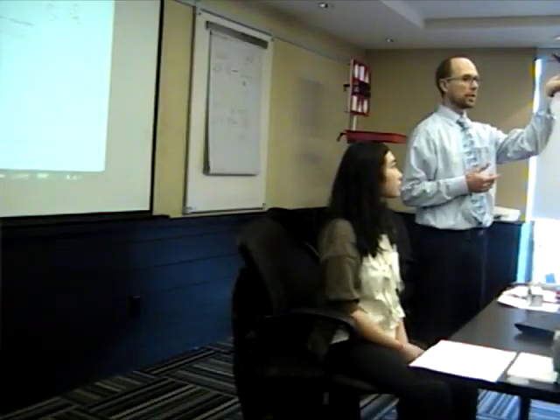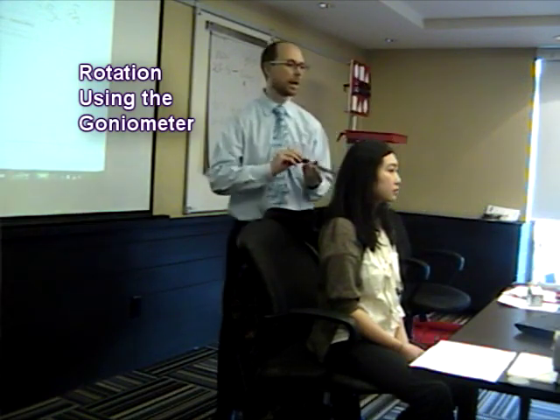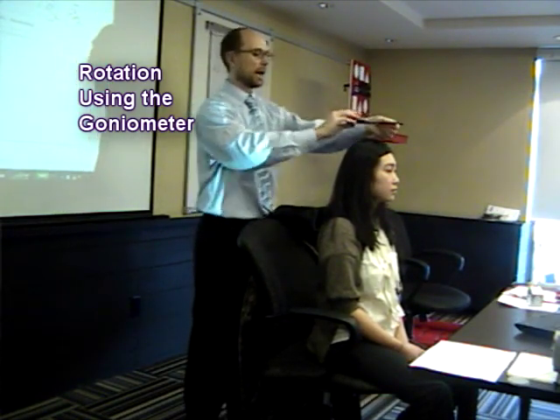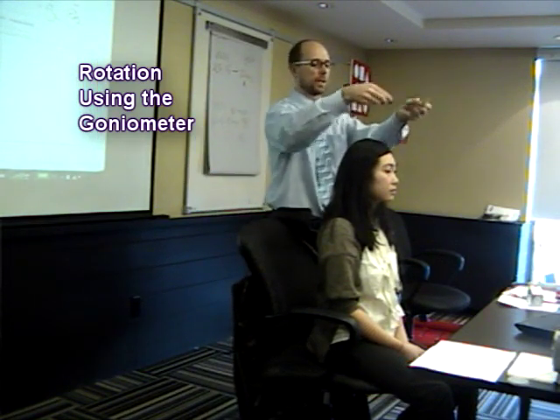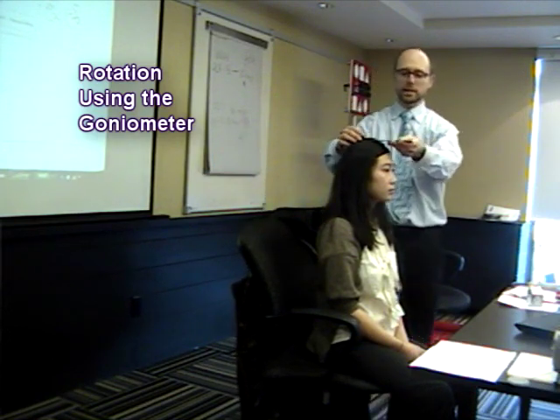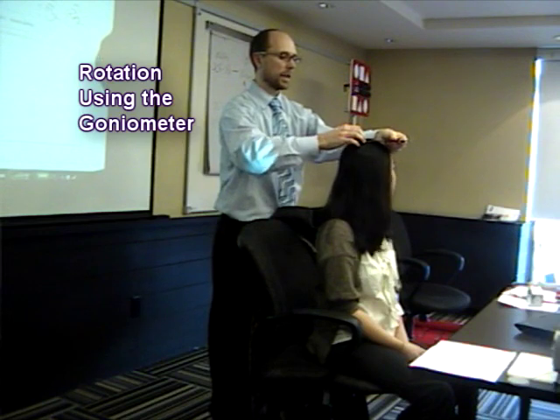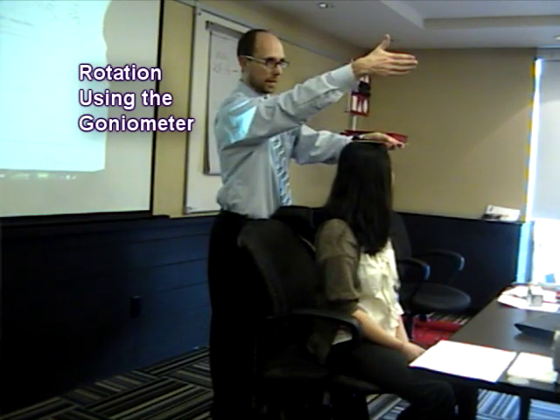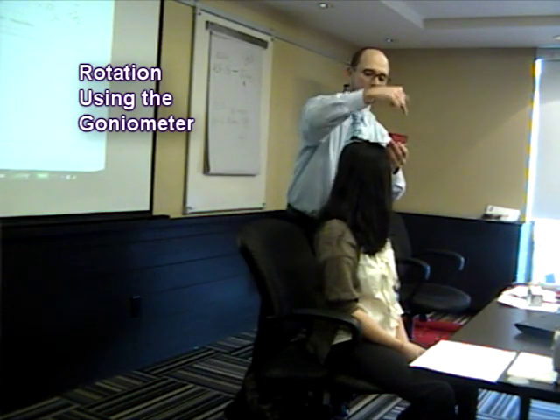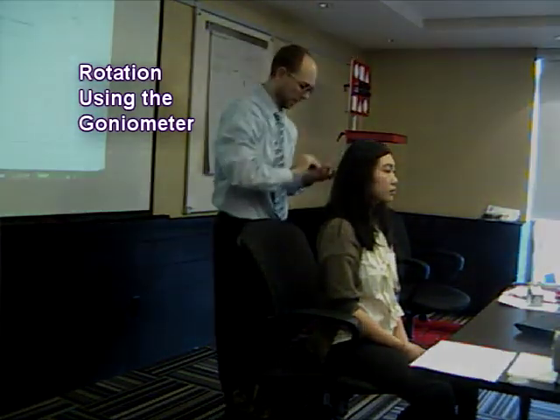The common method is to use this goniometer. I'm going to take the goniometer here. I'm going to pick a landmark so that I have my original landmark, and the bottom one here is going to be pointing at the original landmark. Then I'll get her to rotate off to the left-hand side for me — so she rotates off to the left. I make sure that my original landmark stays in line, and then I use this one here and measure straight down on the nose, and then we have our angle of measurement that way.